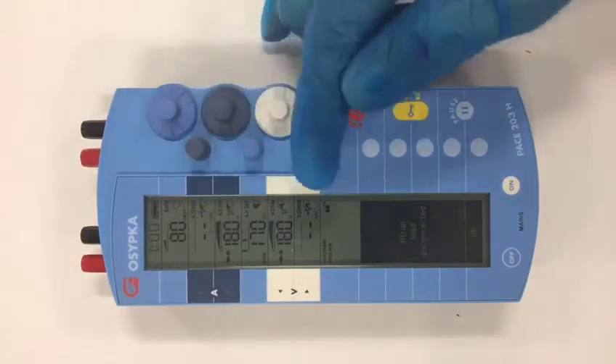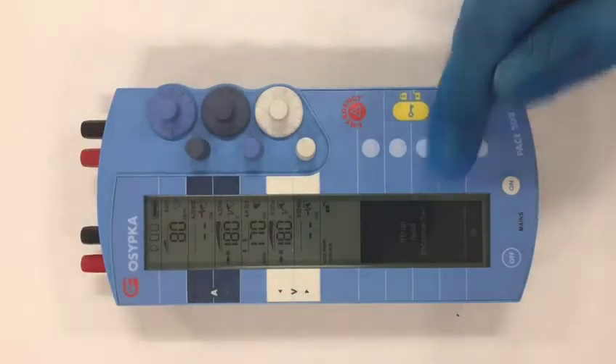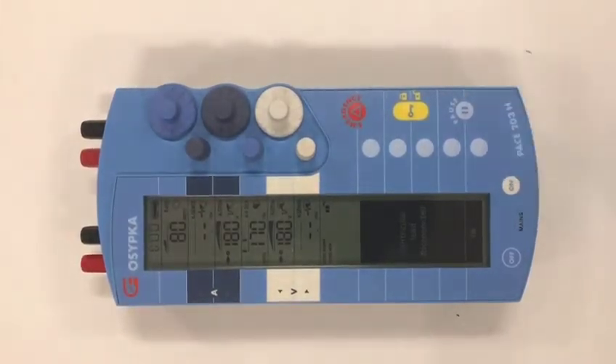There is no sensitivity in the atrium or the ventricle. It will also check to see whether your leads are connected. You can see here the atrial lead is disconnected. Press OK to stop the tone.